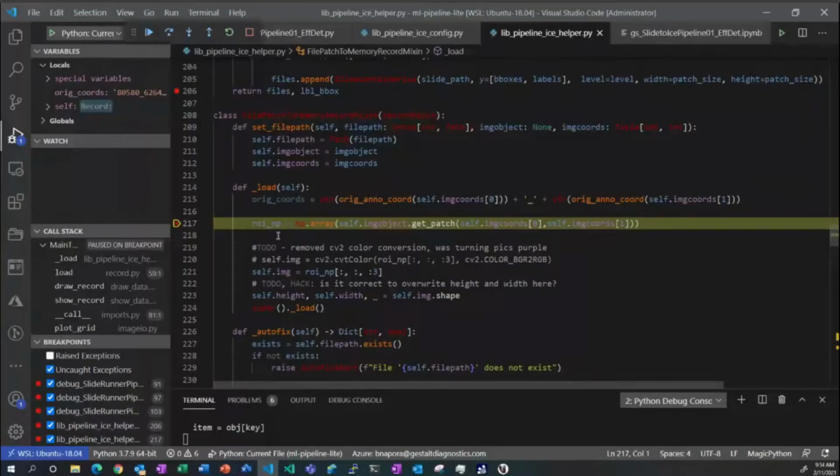for our modeling. The beauty of this approach is you don't have to create the data set at a bunch of different resolutions. You can pick the size and width of your patches for each run and modify that.